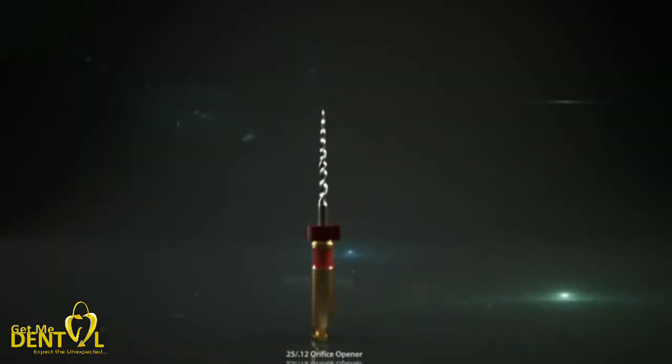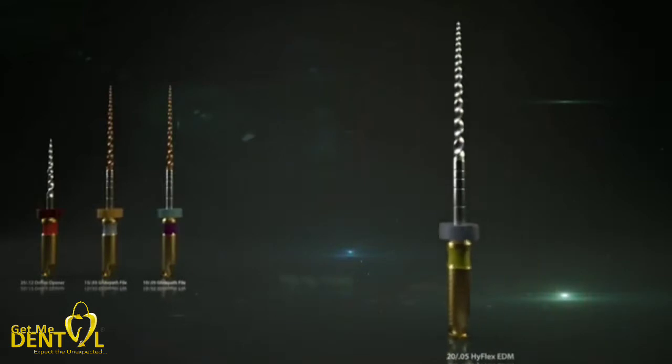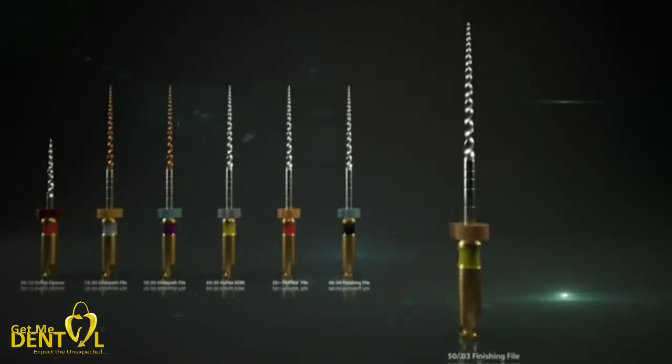The HyFlex EDM family consists of eight different sizes. Each file has been specially developed for another application in the root canal, and thereby the number of files could be significantly reduced. In addition to the standard lengths of 25mm, all EDM series preparation files are now also available in a 21mm working length.